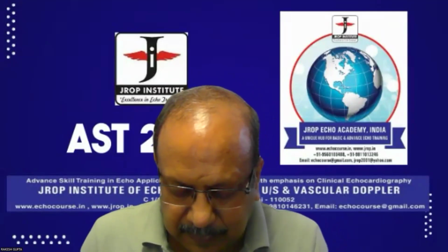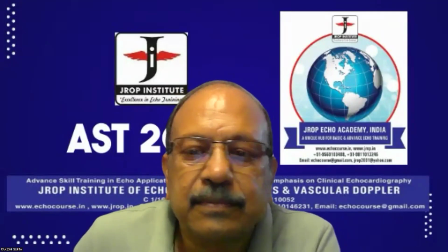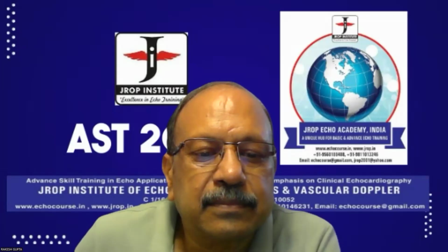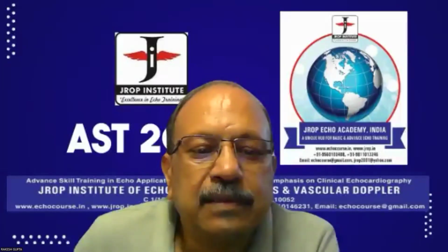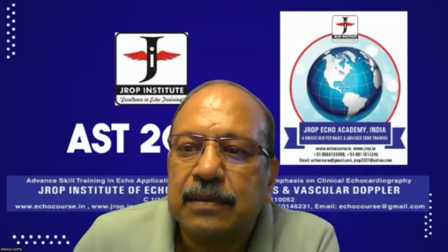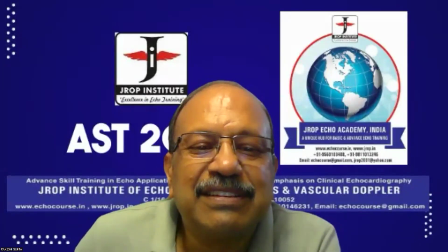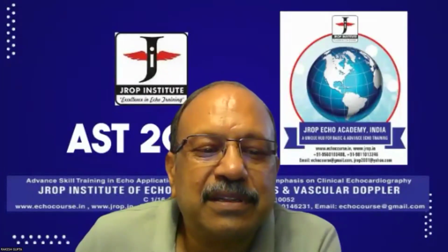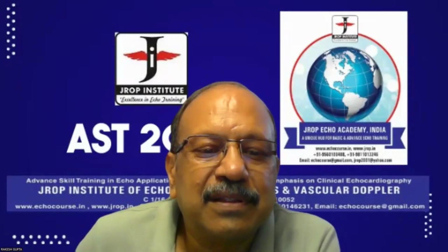Sir, in the evaluation of every valve, I was reading in the book: the morphology, Doppler, and the Doppler calculations. Are these three things enough for evaluation of all the valves? Say it again. Morphology, Doppler, and Doppler calculations. What is left? Are these things the same for all the valves? More than enough. Functional evaluation is done by Doppler only.